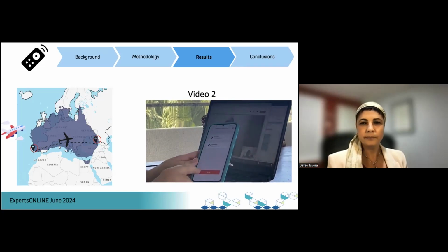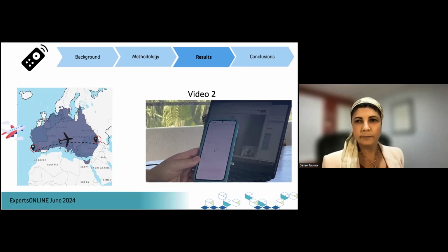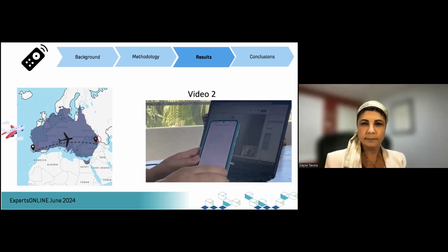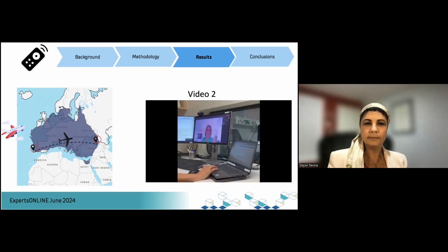So I'm going to just click on the done bar. Hopefully we'll send it to you. And I already have it. I have one configuration, I have one fitting, and I have one telemetry test. So I'm going to download this to my computer. Okay. It's downloading and it is done.